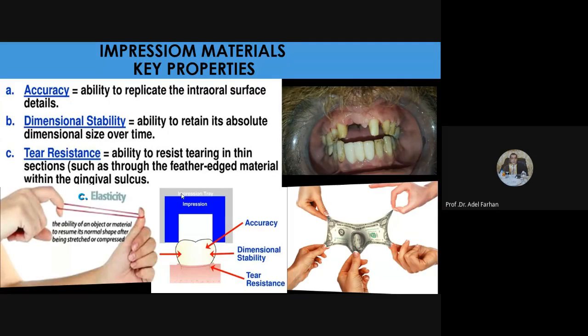Most of material بها byproduct وهسه نشوفها يا ماتيريال، فيحتاج لنا نأخر عملية البورينج for about half to 1 hour حتى ما يصير عندنا ديلي بالبورينج، راسا نسوي له بورينج حتى لان الباي برودكت اذا طلع الباي برودكتس راح يسوي لنا تشينج. فلذلك most of these material that have a byproducts during after setting, within half an hour you should pour this impression.